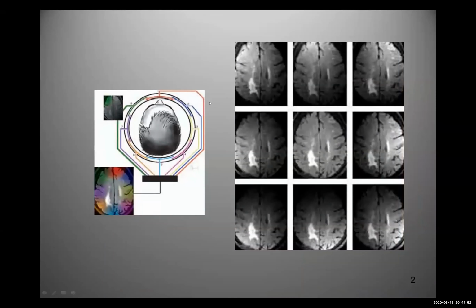That's why the new technology tends to have coils with multi-elements or multi-channels. So we say the phased array coils. Within that coil, you will have smaller coils inside the main coil. So we call them channels, for example, or elements. In this example, we have an 8-element coil. Each element is represented by one coil.